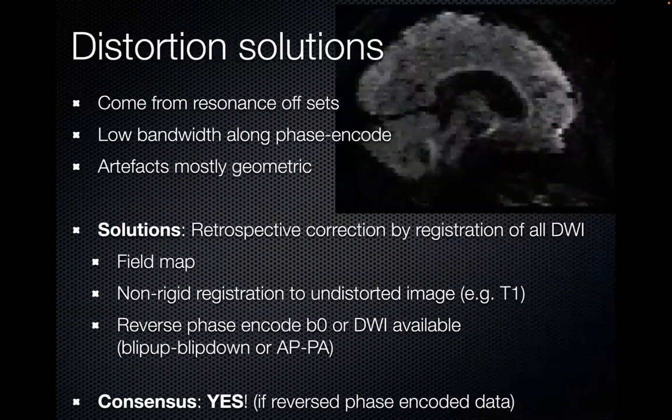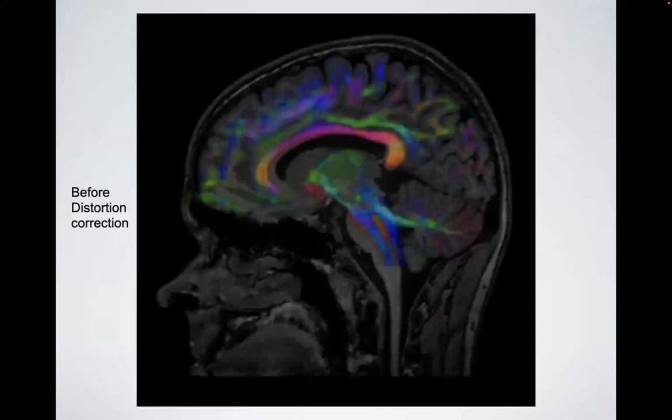Distortion correction in the frontal lobe, in the back. And I'm just going to show you a video here. This is before and after. Whoops, sorry. You see this brainstem here? And I purposefully put the anatomy behind. The T1 weighted image is not distorted. But the diffusion image, if you don't do anything, is distorted. Look at the frontal lobe. Here it's stretched. The corpus callosum is not even on top of the real corpus callosum. The brainstem is, this is a non-linear deformation because we're acquiring data quickly.